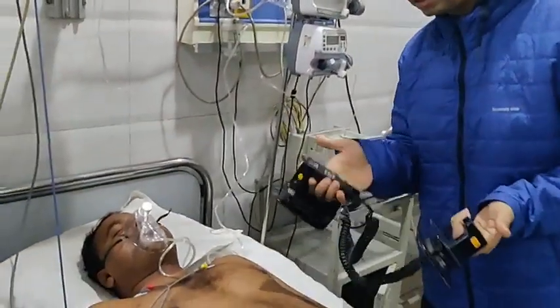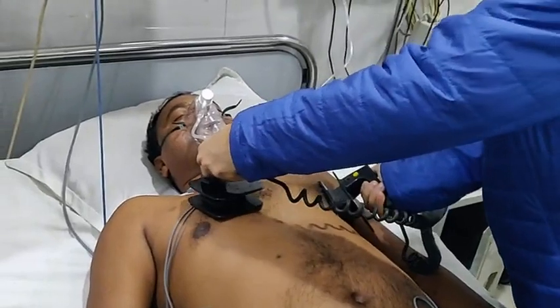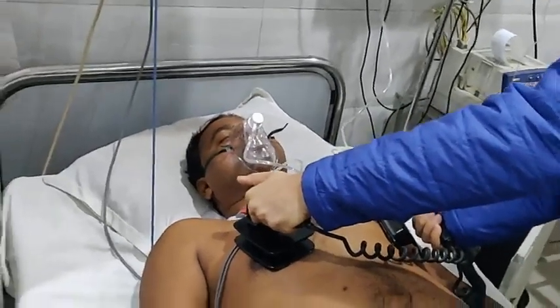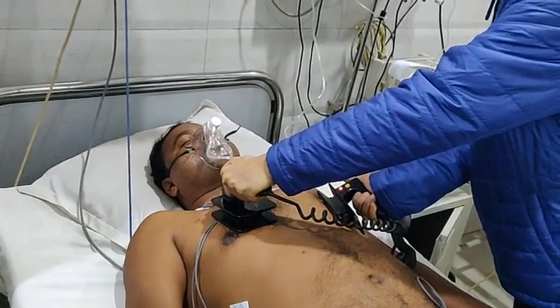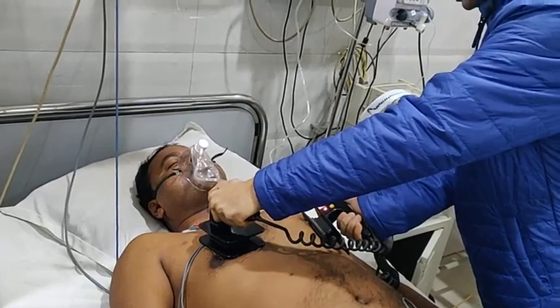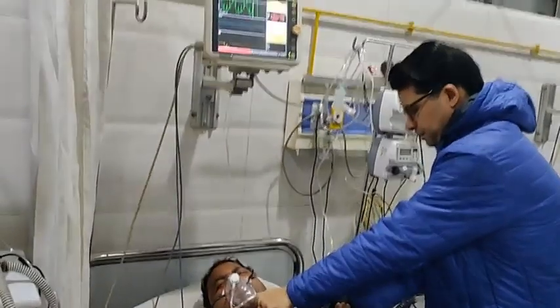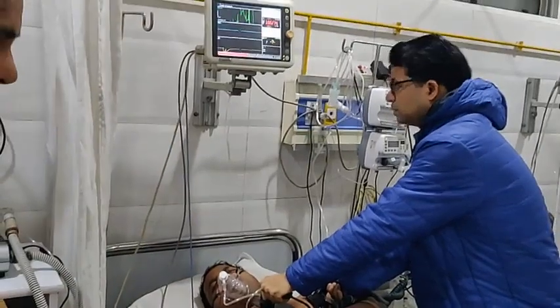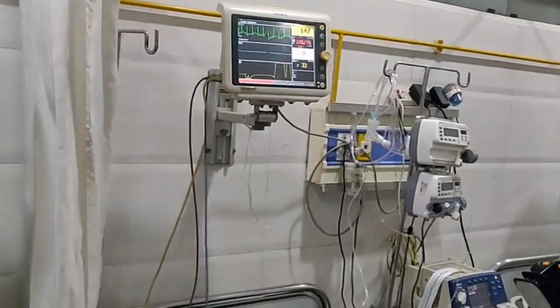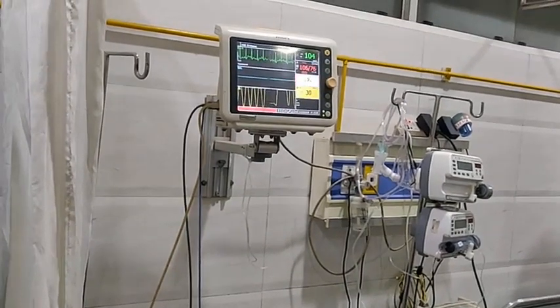You have to place the apex paddle around this area and the sternum paddle at this place. I have synchronized this — you have to monitor it continuously and show the monitor along with this. So this is how the rhythm gets reverted. You can see now the heart rate — it is normal sinus rhythm.